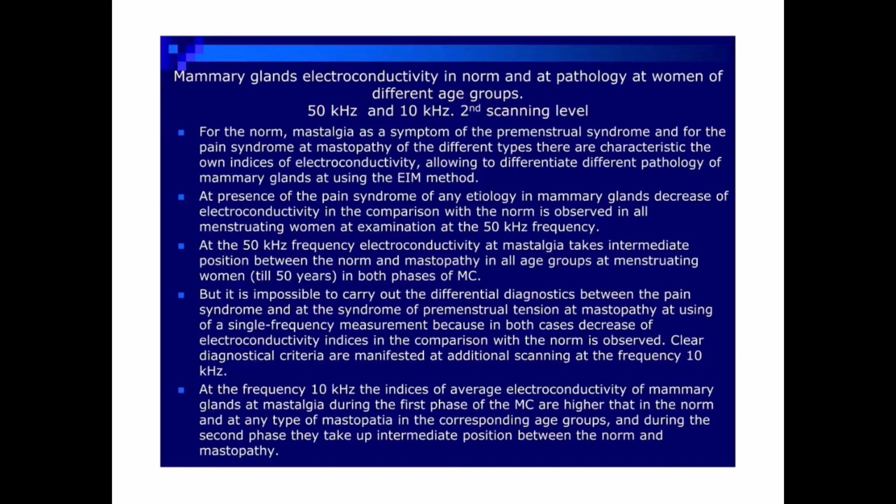But it is impossible to carry out the differential diagnostics between the pain syndrome and the syndrome of premenstrual tension at mastopathy using a single frequency measurement, because in both cases a decrease of electroconductivity indices in comparison with the norm is observed. Clear diagnostic criteria are manifested at additional scanning at the frequency 10 kHz.